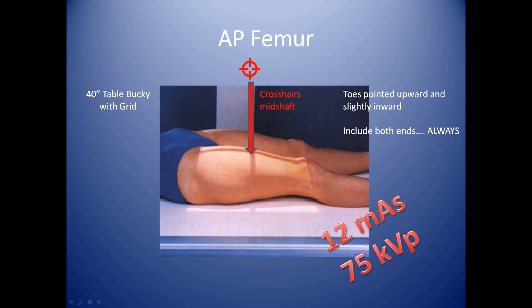For the AP femur, we'll be utilizing the table bucky with the grid. It will be 40 inches away from the bucky. Your camera should lock in place — make sure you lock it in place longitudinally as well as width-wise and height-wise so that your examination will go on without a hitch.